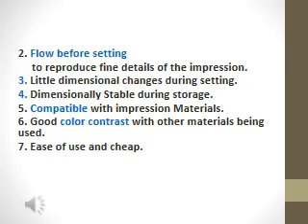Number 6, good color contrast with impression materials being used. This facilitates easily distinguishing the two materials from each other, and you can separate them. Number 7, of course, ease of use, okay, and cheap.